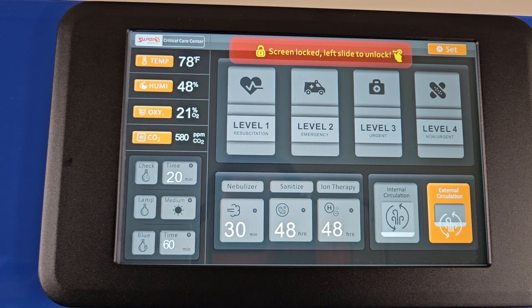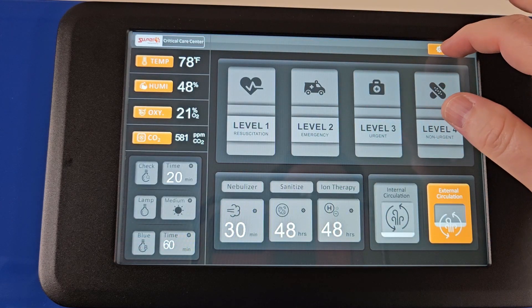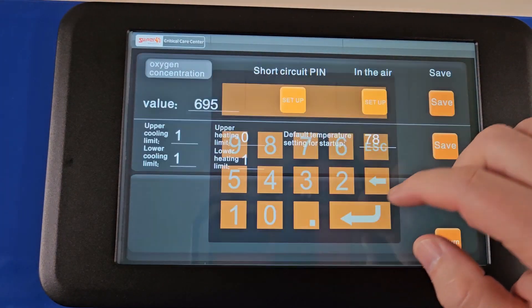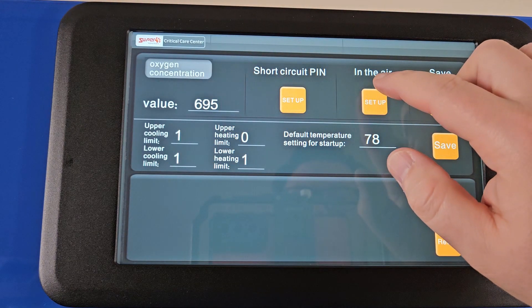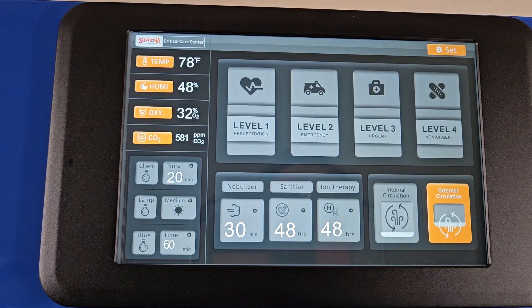To calibrate the oxygen sensor, tap Set at the top right of the screen and enter password 66. Watch the value in the upper left to ensure that it is stabilized, with no major variations beyond a few numbers up or down. Press Setup under In the Air, then press Save to the right of Setup, and tap Return to return to the main menu.